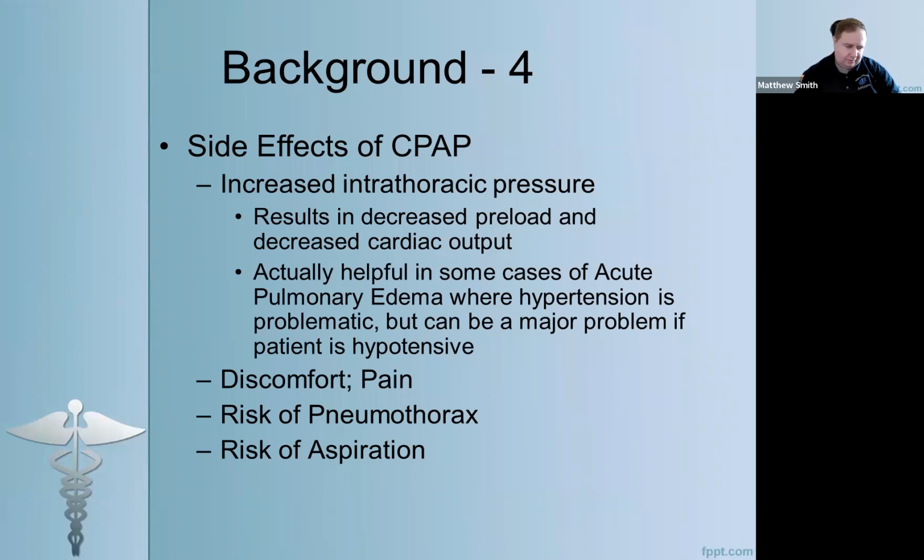Now, I would be very judicious with how you interpret that. I think if you have a patient with a systolic of 104, I don't think you should say to yourself, oh, well, I don't have to worry, right? Be very cautious, because this can have a huge effect on cardiac output, and the last thing you want to be doing to an already sick patient is dropping their pressure.